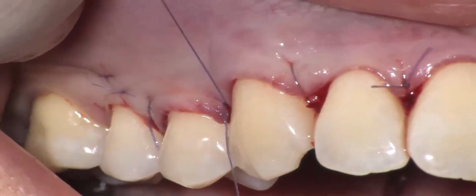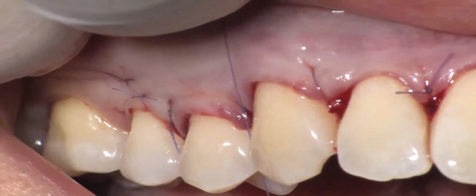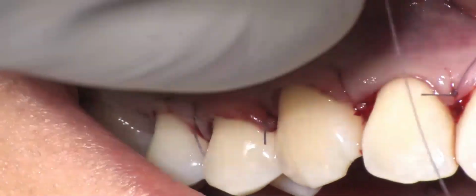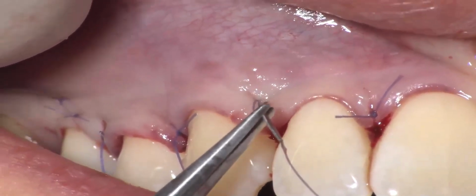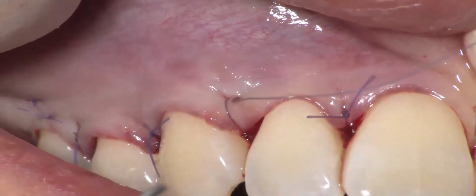So now you see that the keratinized tissue, both at the level of the premolar and the canine, is well adapted to the convexity of the clinical crown. I left this papilla with no knot so I can improve again the coronal advancement of this flap.